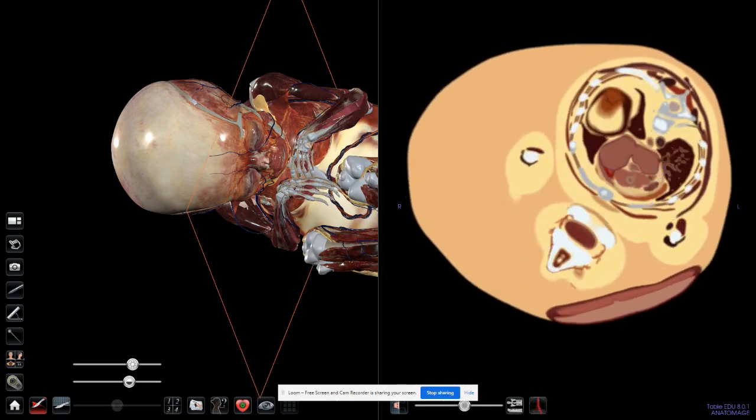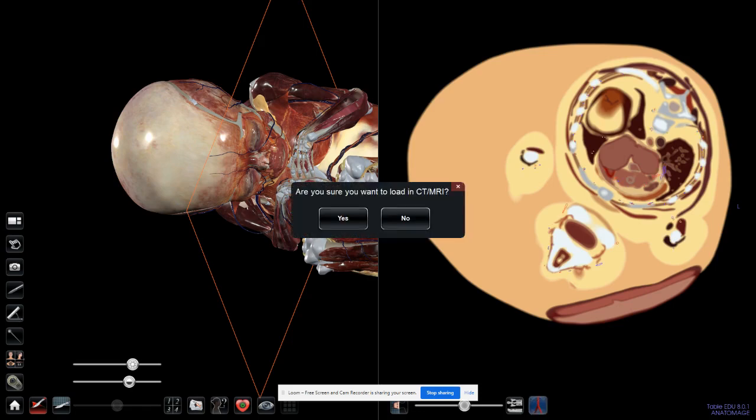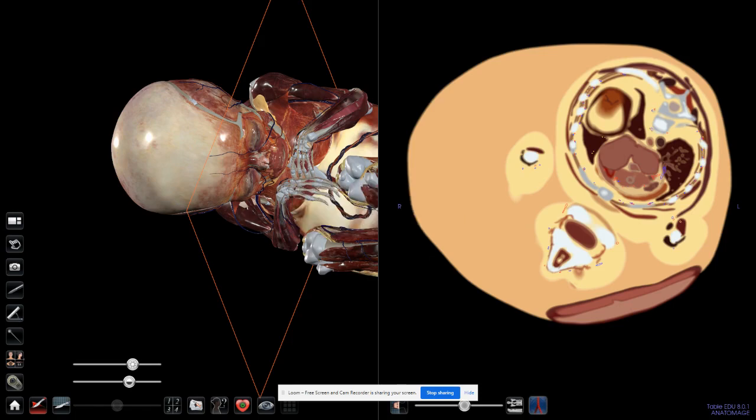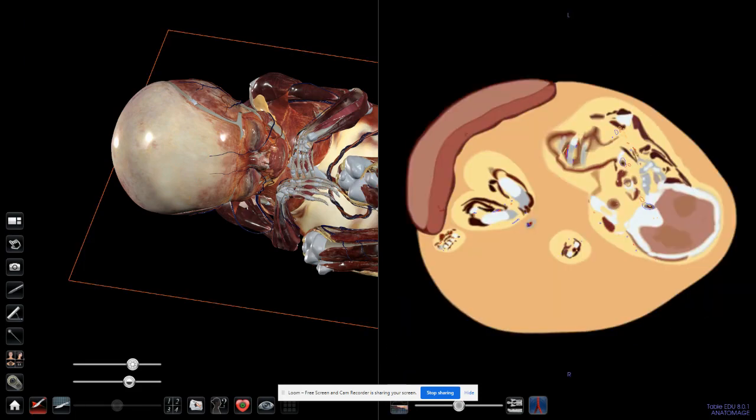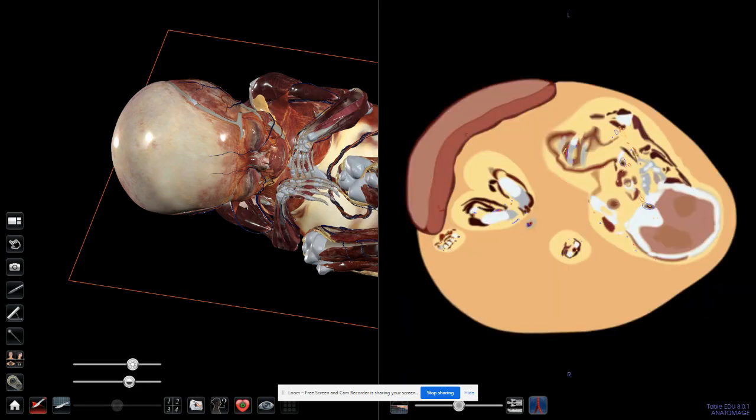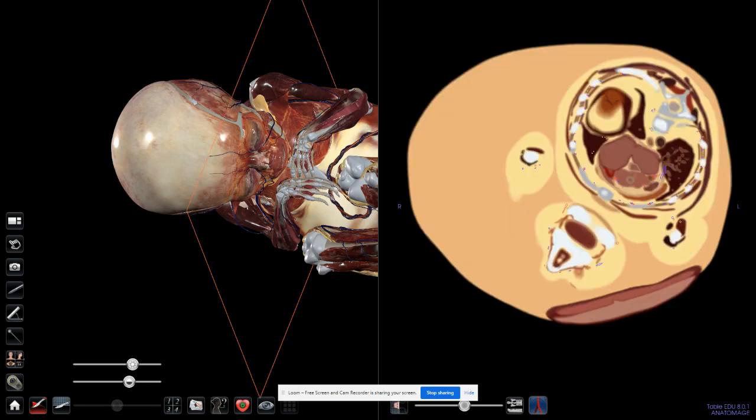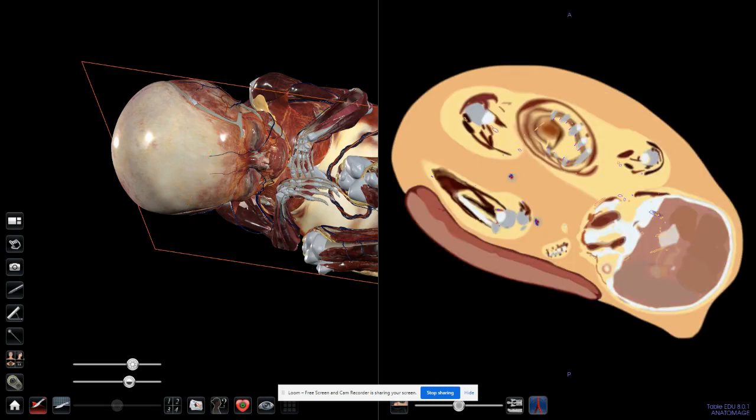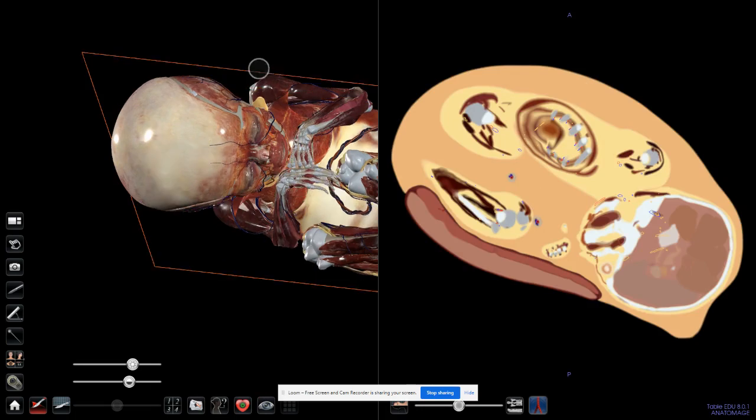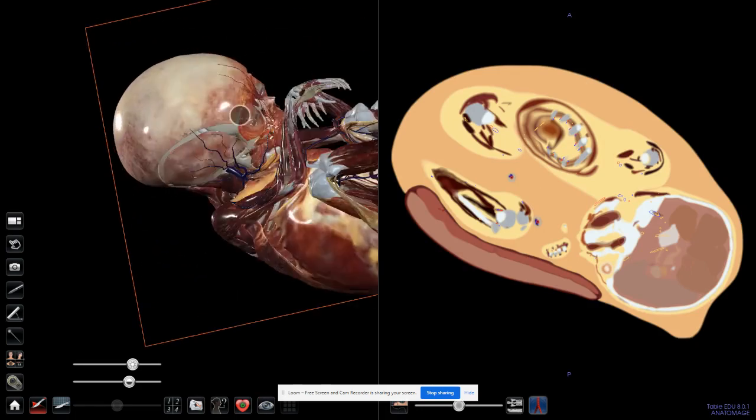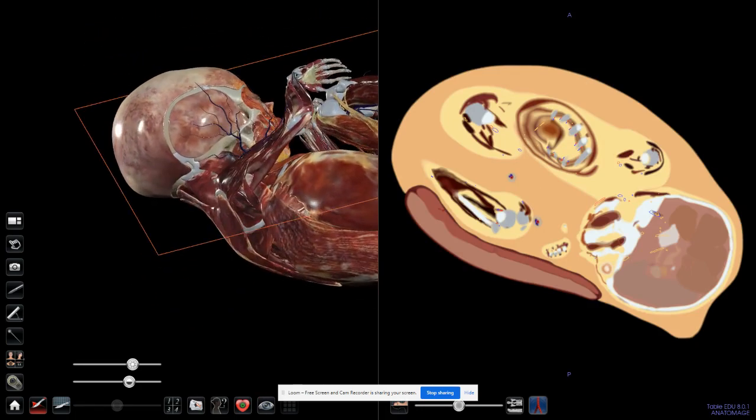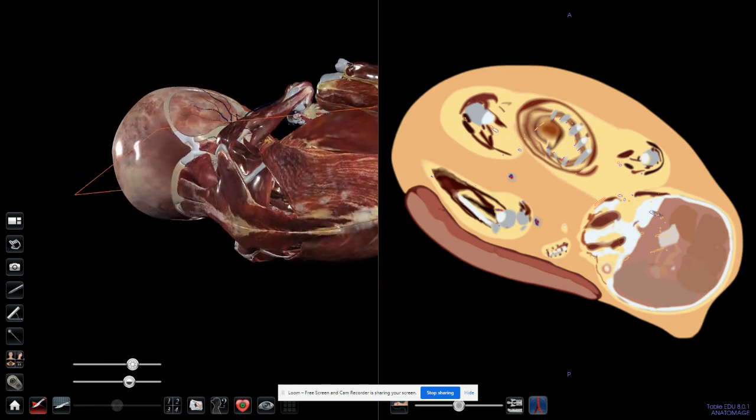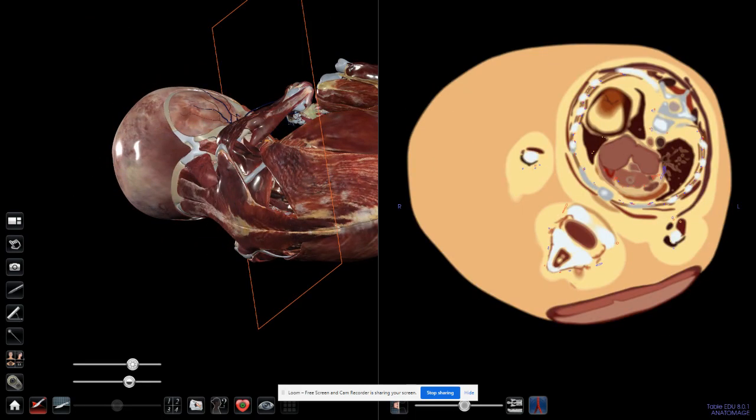This button here also shows me the vessels. This button here allows me to load CTs or MRIs if allowable. As you can see here, the cross-sectional changes. The orange line is changing, so it can be across, vertically, or horizontally passing through it.